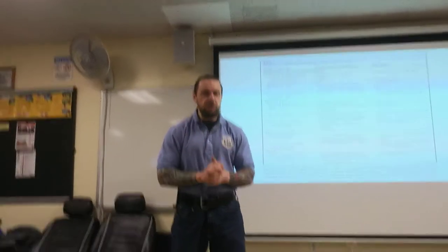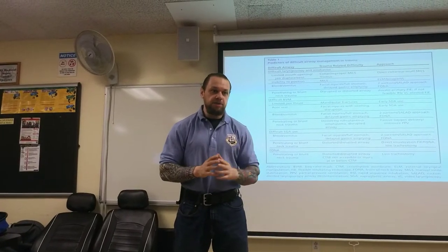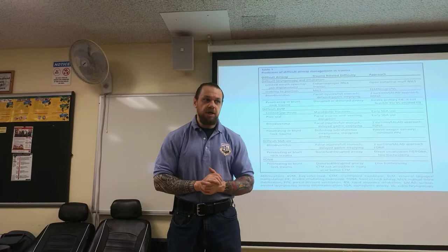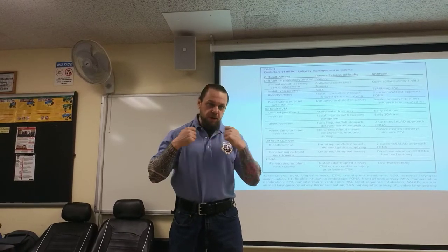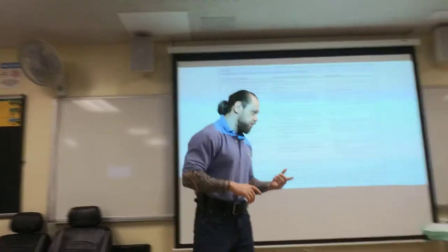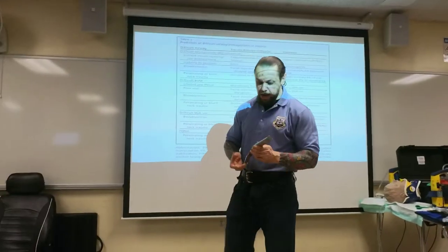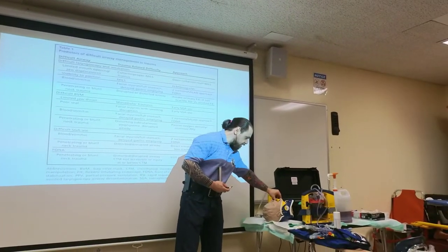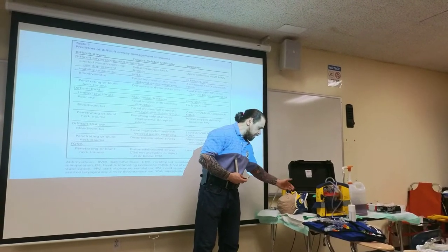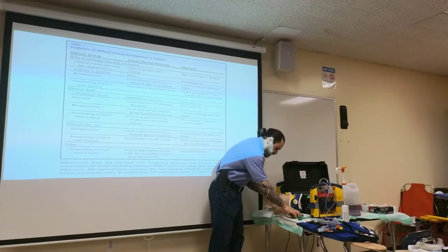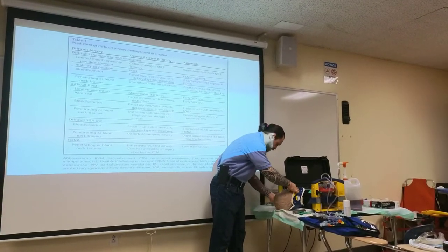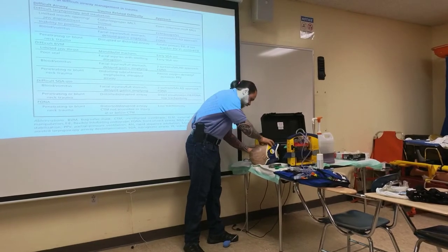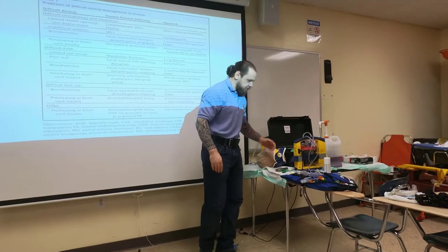That's why you go with the bougie. We're going to talk about how we can overcome it. Somebody is going to hold manual inline stabilization — we call it MILS. The reason why that is important is that we need to open the collar to perform this procedure properly. When I use my laryngoscope, I have to displace the mandible — move it forward and up — so I can pass the tube. If you have a rigid collar, it's not going to let me move the jaw or displace the mandible. Also, if I'm going to pre-oxygenate this patient, I cannot do a good jaw thrust with the collar in place.